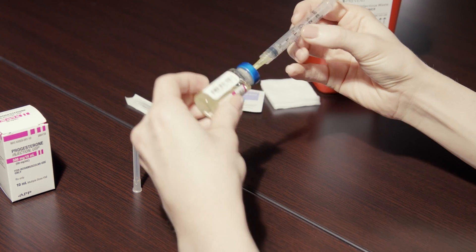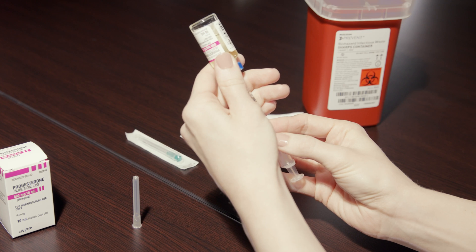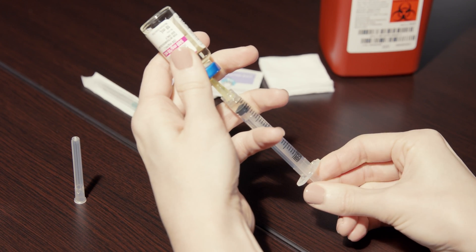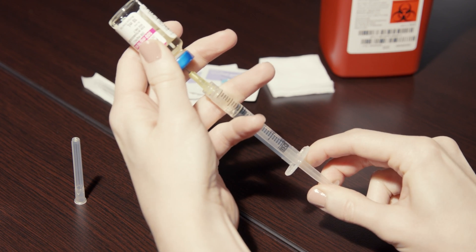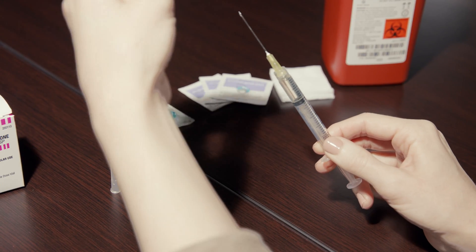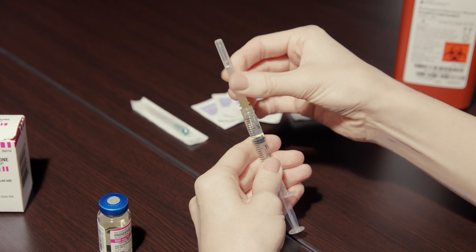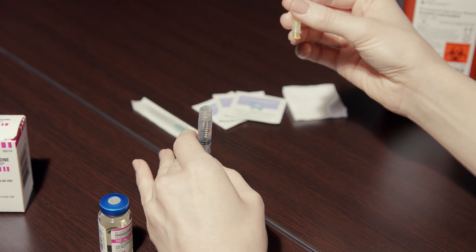Invert the syringe so that the vial is upside down but still attached to the syringe. Pull the plunger until the correct dosage of medicine enters the syringe. Take the needle out of the vial and replace the cap. Screw off the needle and place it in the designated sharps container.